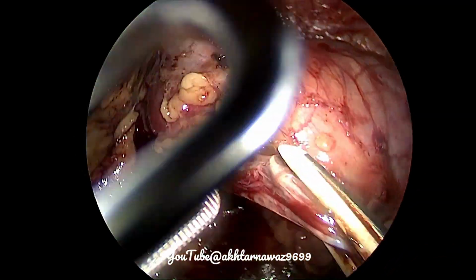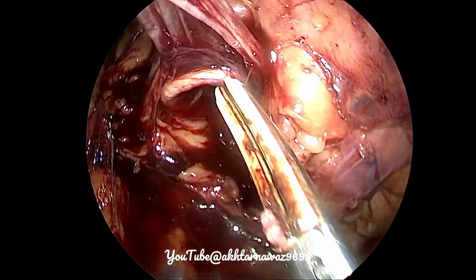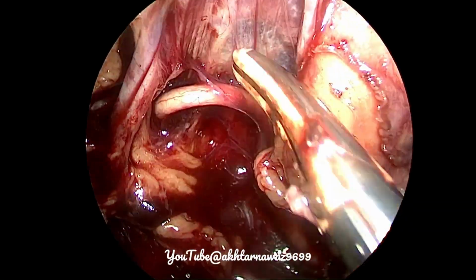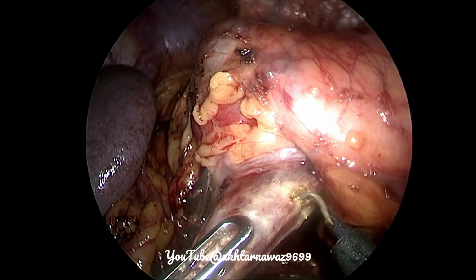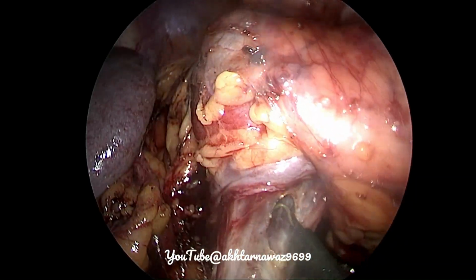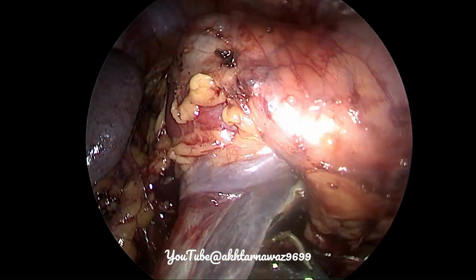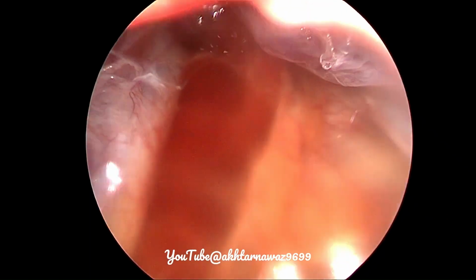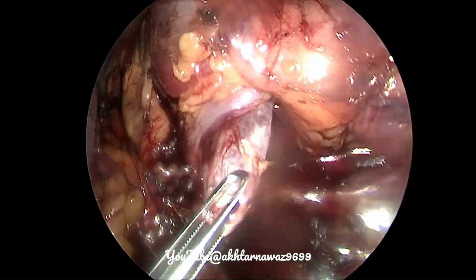So here we dissect a little more of the cyst from the pelvic calyceal system, and we'll make a big window and excise the wall, which is in fact called the deroofing. So we do deroof this parapelvic cyst, and we keep the stent for 2 weeks. This is the view from the inside of the parapelvic cyst.